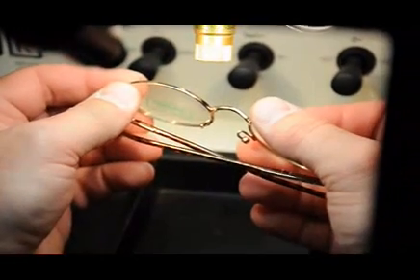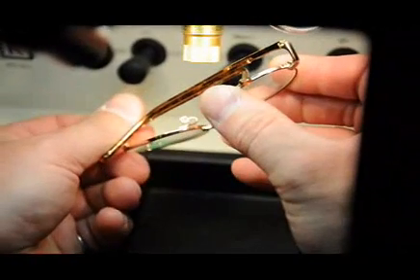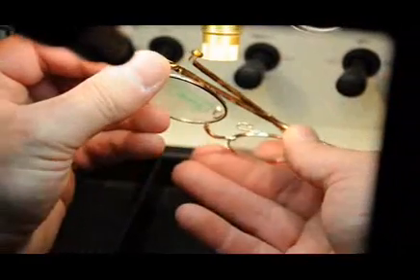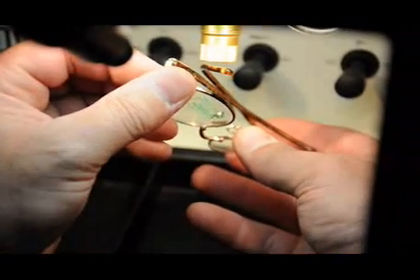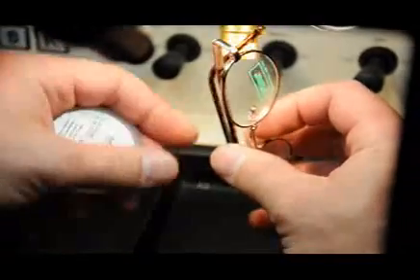Now that the alignment is correct, the operator will stitch and weld the assembly around the perimeter, ensuring a homogeneous flow. You'll note that he has free motion of the part by holding the eyeglasses in his hand, and there is no damage to the lenses.